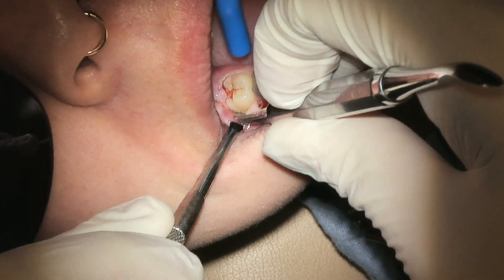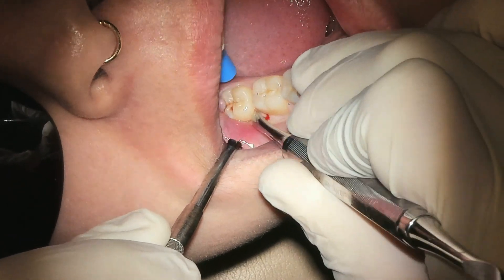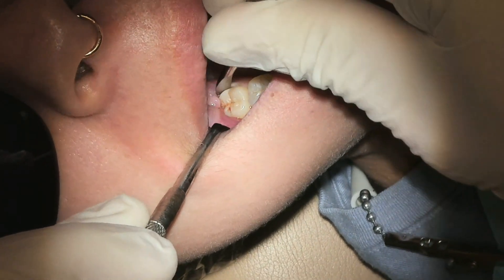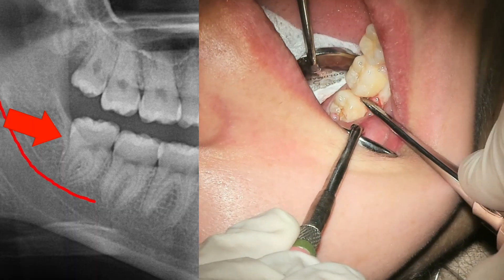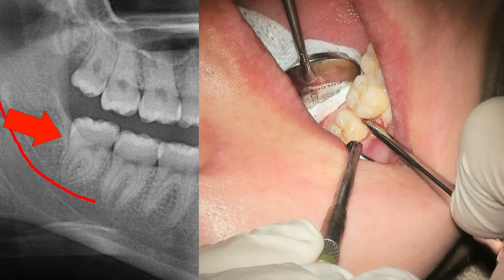I want to talk about a couple of techniques. There are a few different techniques you can do, but all of them start with elevating. Unfortunately, this tooth — we're not able to elevate distally very much at all, about maybe half a millimeter. So I'm not able to elevate very much more to the distal due to the ascending ramus blocking the tooth from that distal movement.